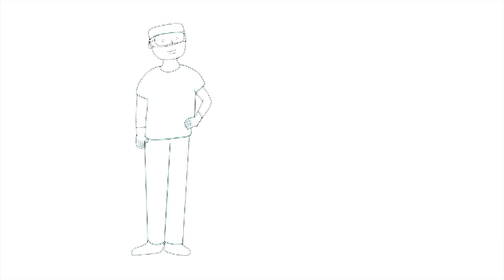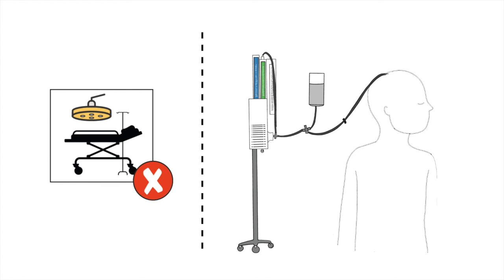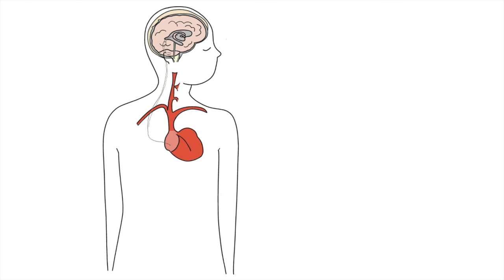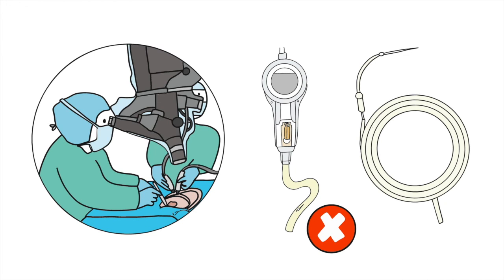Your doctor may do anything else he or she deems necessary at the time of surgery. This includes aborting the surgery, placing a temporary catheter or external ventricular drain, changing the side of the body on which the shunt is placed, or changing the desired location of the catheter tip. If the shunt is being revised or fixed, it is up to the surgeon at the time of surgery to determine which components are not functioning and need to be replaced.